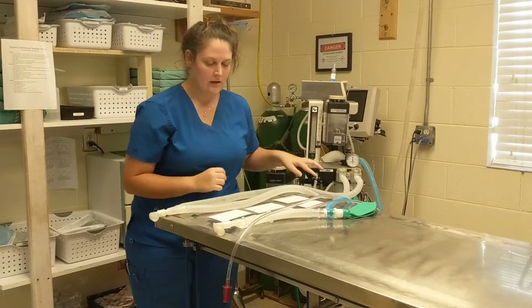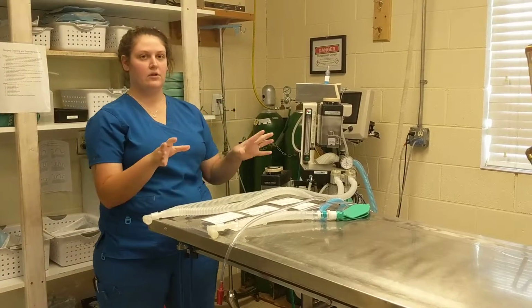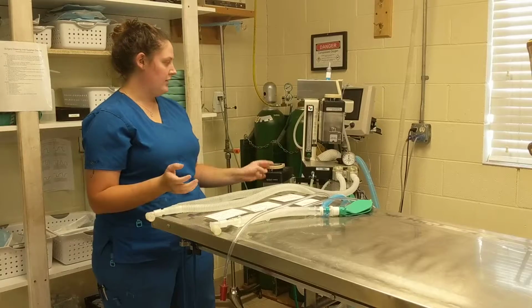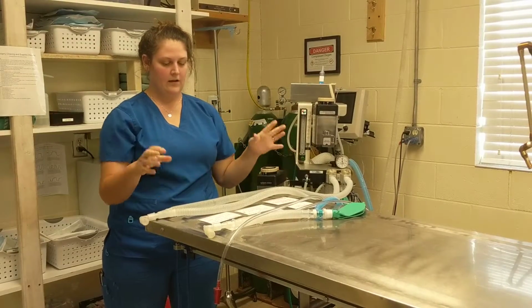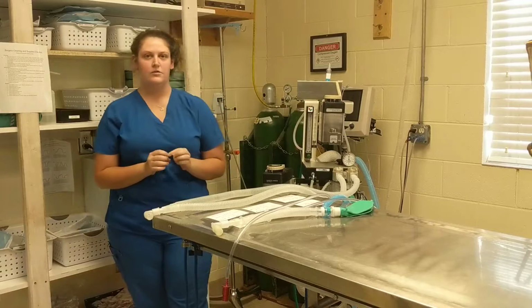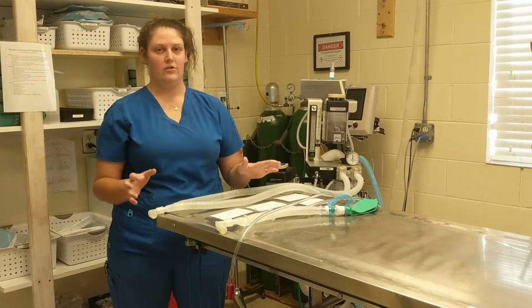In conclusion, it's important to know all the components to control our anesthetic depth. An anesthesia machine has three factors it controls: oxygen, a maintenance drug, and our patient. Again, anesthesia is considered controlled death. When properly used, we provide safe, controlled pain management and comfort to our patients.